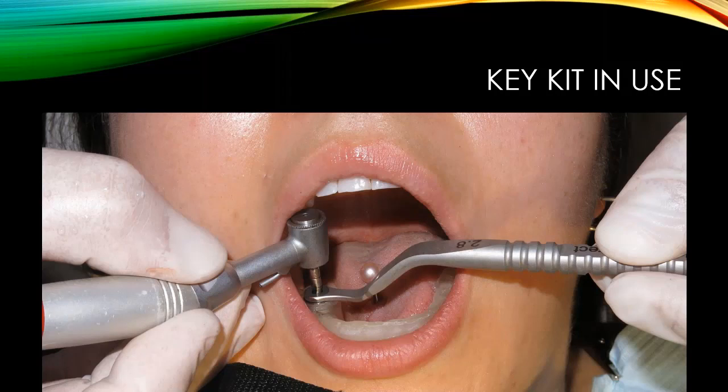In the mouth, this is what it looks like. Guide in place, and the guide fits retentively. Again, the software has the ability to see height of contour on the teeth to create enough friction for this to fit. Obviously, there's some parameters. You have to have enough teeth to get a stable fit. There are other techniques that are based off of soft tissue, but for the most basic guides like this, they're tooth-borne guides.